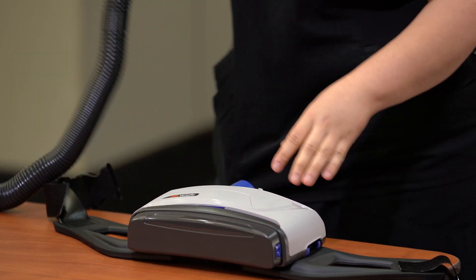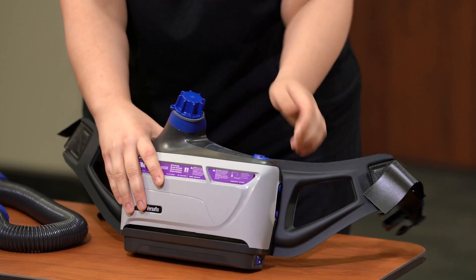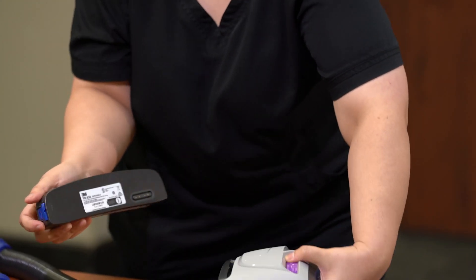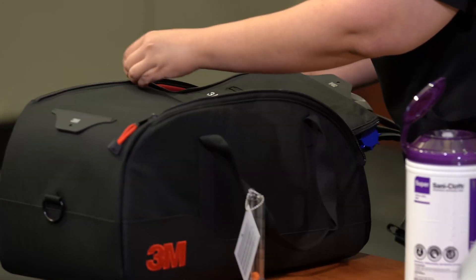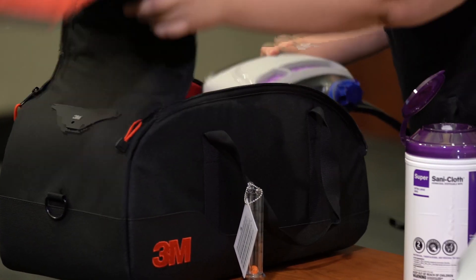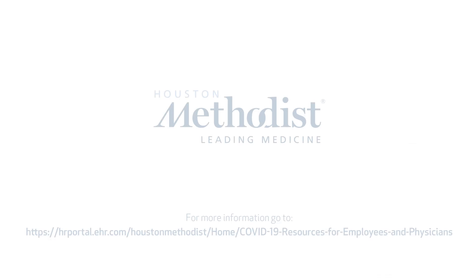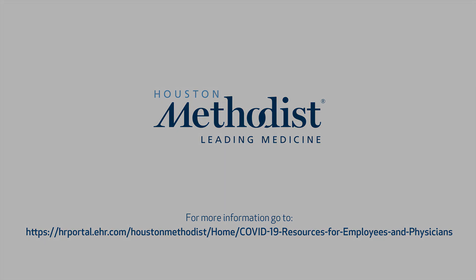Disconnect the hose from the blower assembly. Place the protective cover on the airflow port of the blower assembly. Disconnect the battery from the blower assembly and place it back on the charger to charge. Return components to the PAPR bag and store the bag on a clean surface.